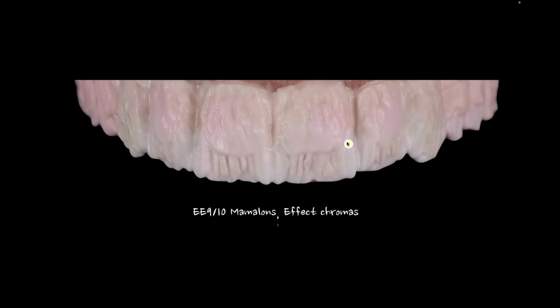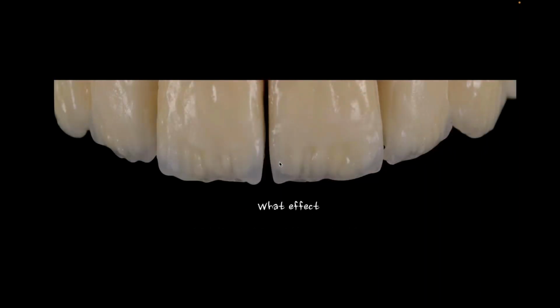And then the powder that you see here is just an EE1, a little bit of a whiter, brighter powder that I'll feather up to kind of transition between where my base dentin is and where my enamel effects are going to go. And I fired that. I wouldn't normally fire it, but I did just to kind of give you an example of what happens with the effect.